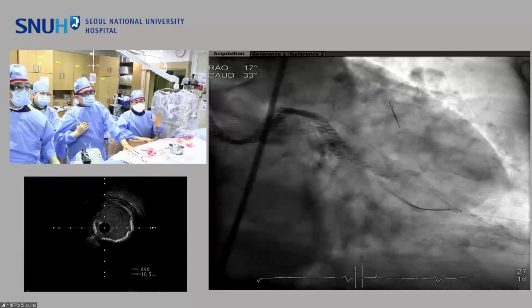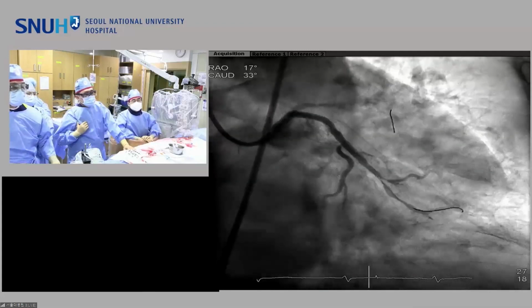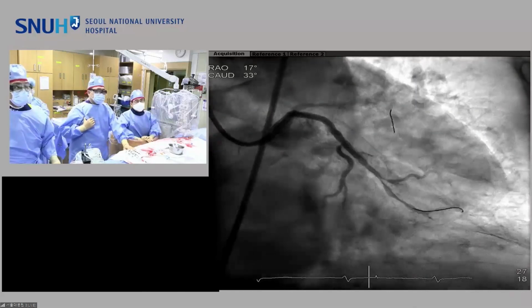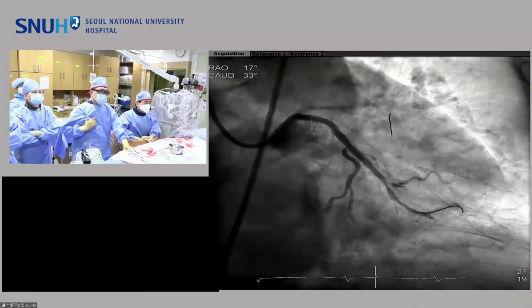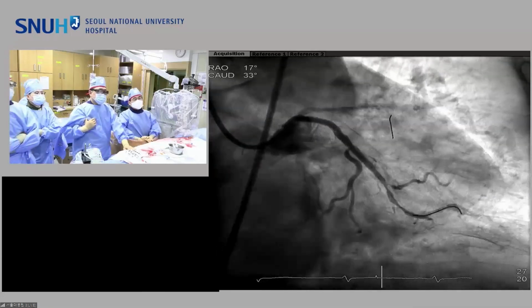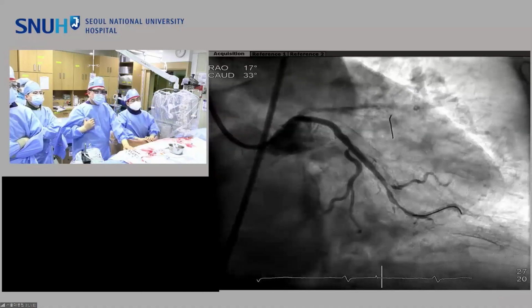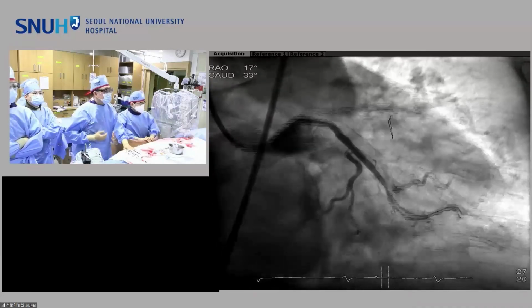So before ballooning, the minimum MSA was 2.97, and the proximal site is less than 5 square millimeters. The final IVUS, please. Yeah, this is the final IVUS imaging. We don't see the stented area IVUS images. We are not seeing the IVUS images.